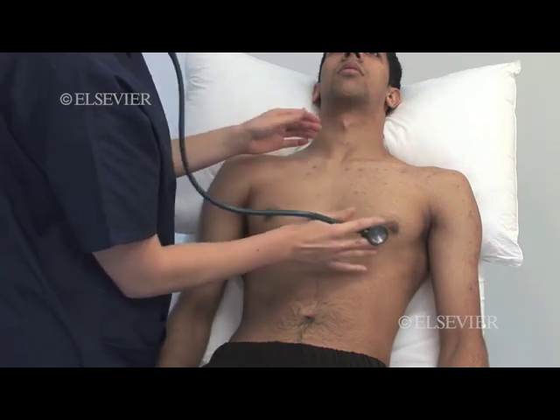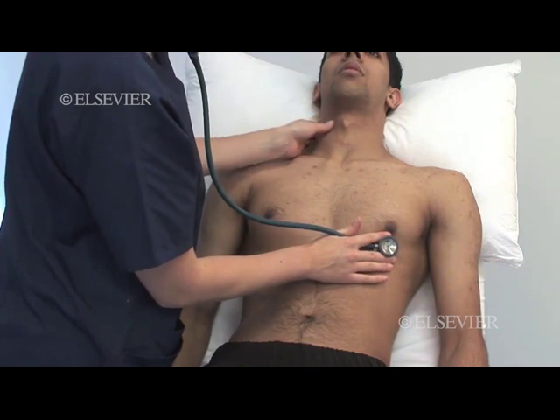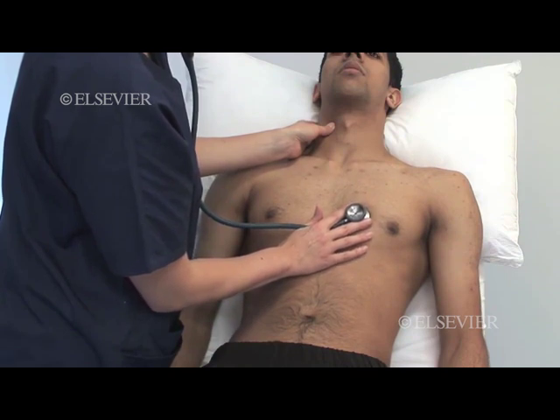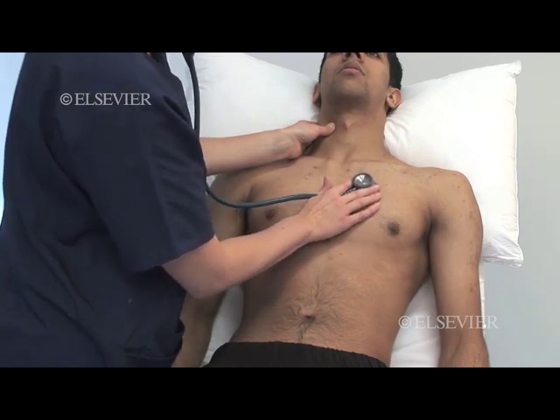Listen to the precordium systematically with the bell and then the diaphragm. Listen at the apex where you felt the apex beat. This is a good site to hear mitral murmurs. The lower left sternal border is the best place to hear the murmur of a VSD.